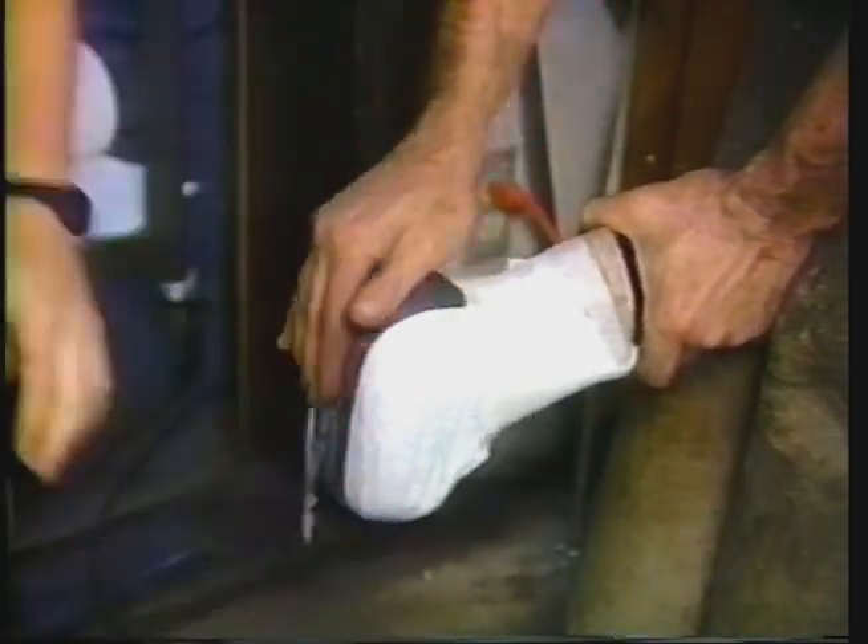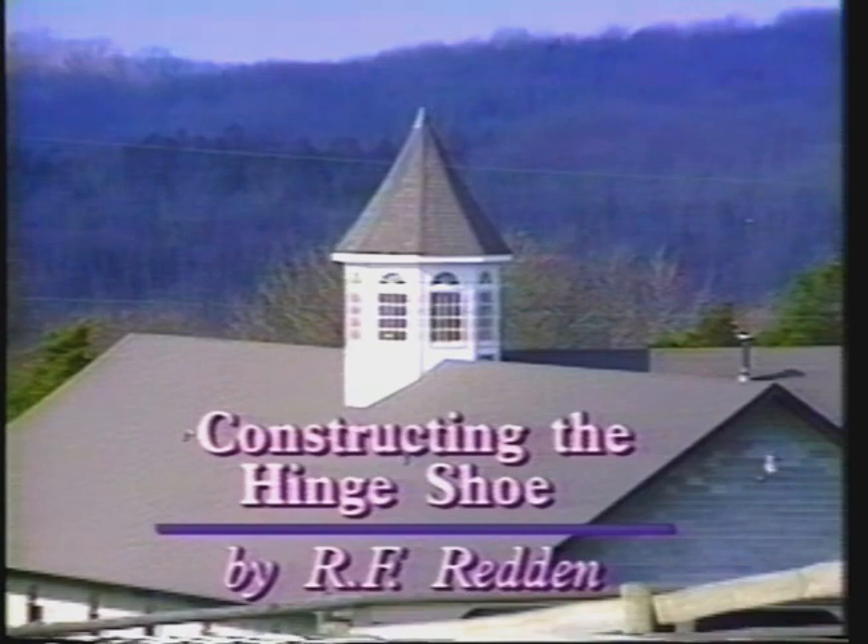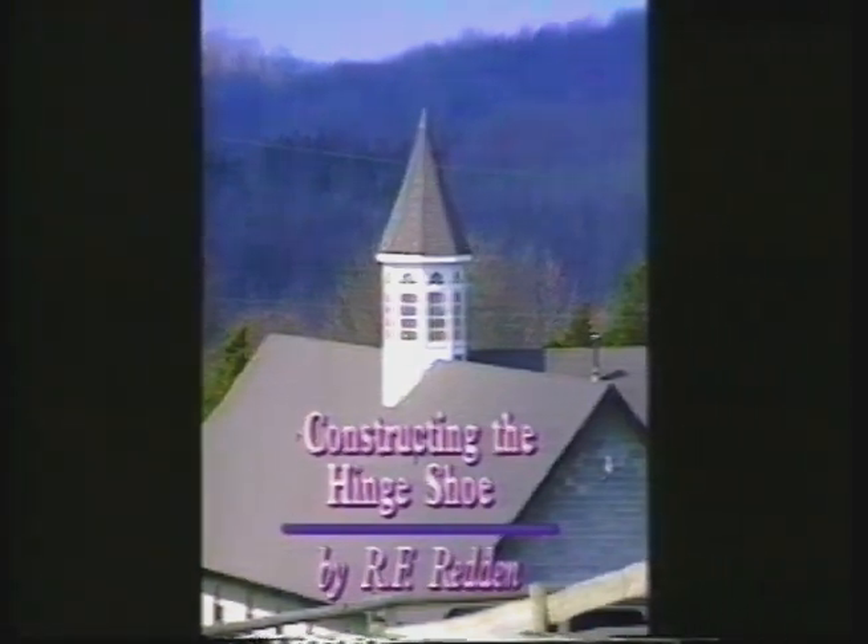A unilateral heel can be pushed in. A particular medial heel on a toed-out individual can roll in very hard. By pushing the heel out mechanically, you also allow the bulb of the heel to come down. This particular construction guide is designed to take you step by step in explicit detail as to how I would design a hinge shoe. Once proficient at this shoe, you can allow yourself 45 minutes to an hour to construct one shoe and apply it properly.